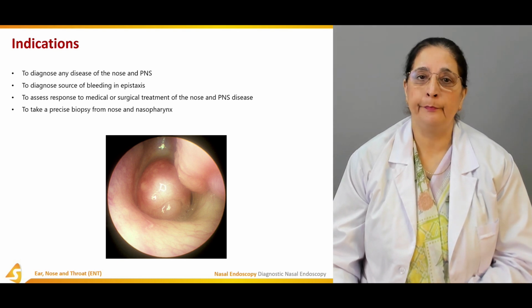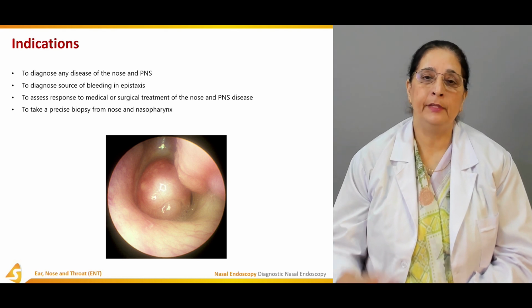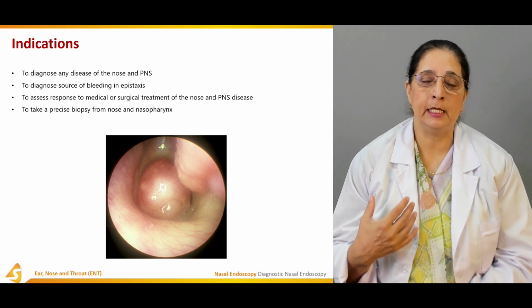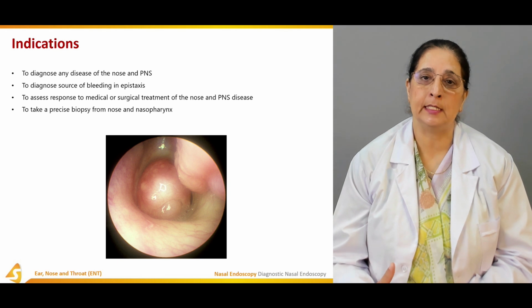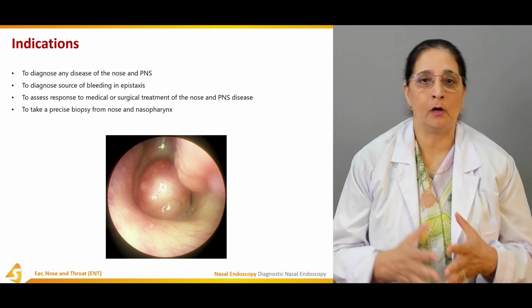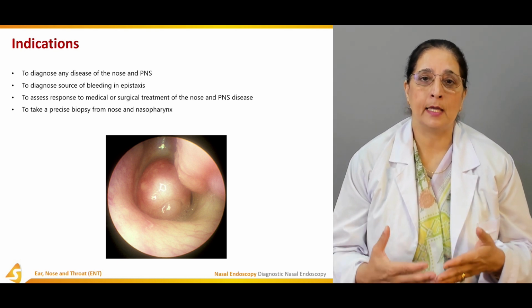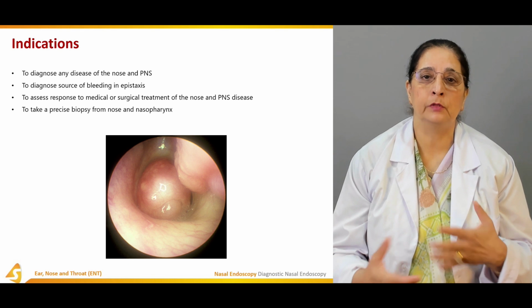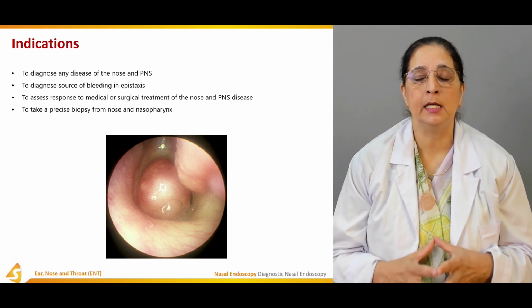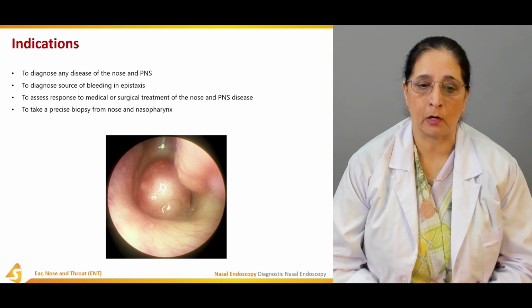Endoscopy is also used to take a biopsy from the nose and nasopharynx. If there is any growth or mass present, we need to look for whether it is benign or malignant, or some other mass such as an inflammatory growth, we should do a biopsy, and the biopsy can be performed using nasal endoscopy.